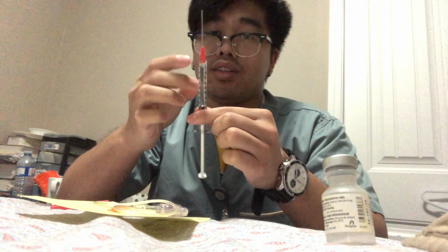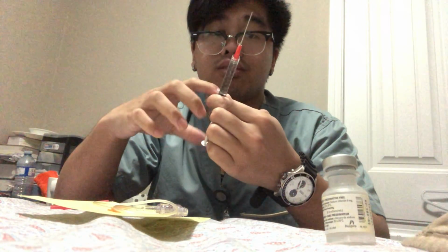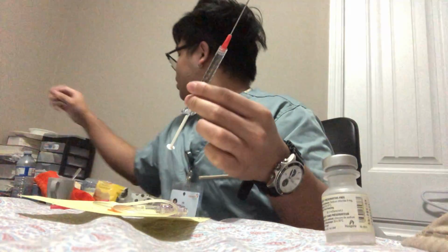Now that I've done that, if there's any air bubbles in here, carefully flick it like that until it goes up, and then take the remaining off, and then take the remaining off on the sharps container. Okay, good.